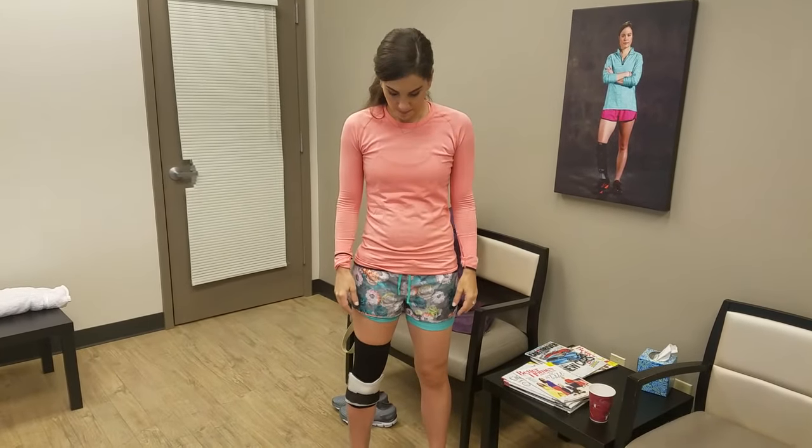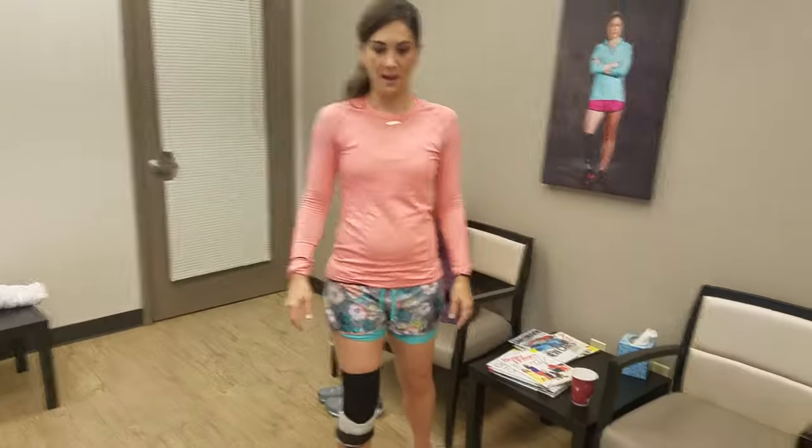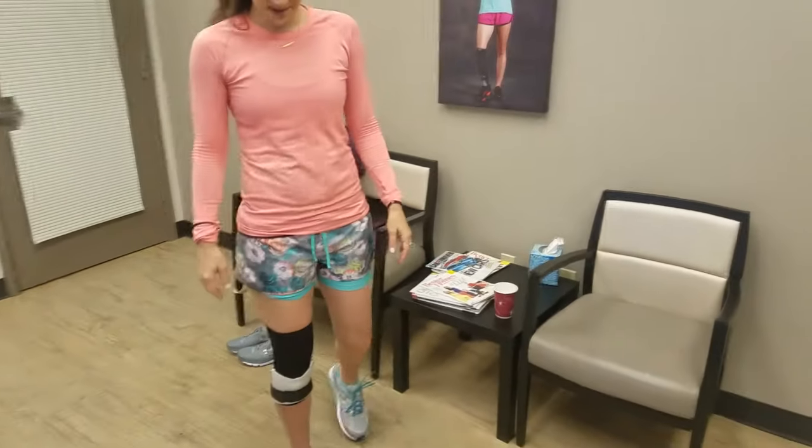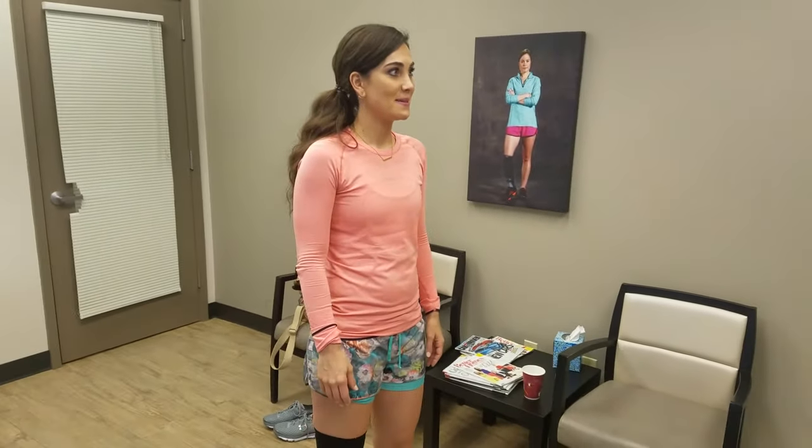Ryan mentioned that I really need to just forget everything I used to do and how I used to walk. I have to retrain my body and retrain those muscles that I haven't been using properly, and engage my core a lot and my glutes, and take shorter, faster steps. Some things I'll have to work on and get better at, but just initially — without that shooting ankle pain. So it's pretty amazing.